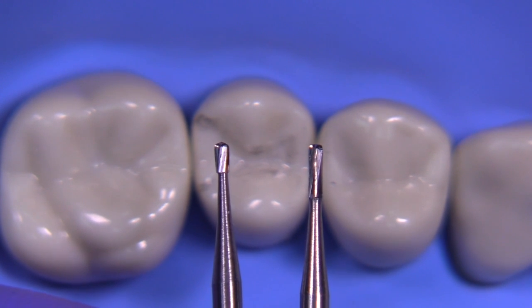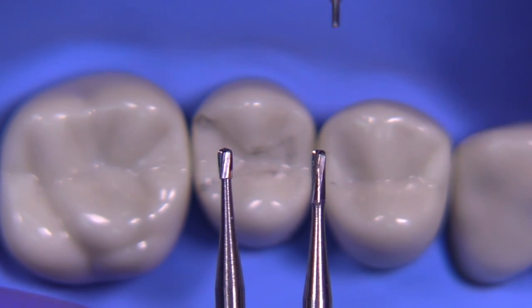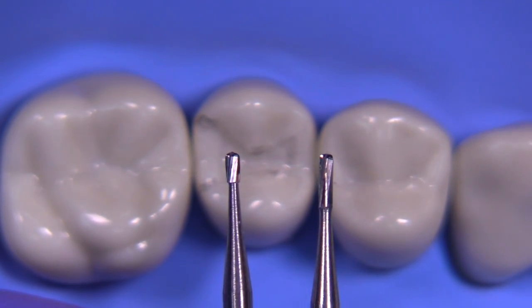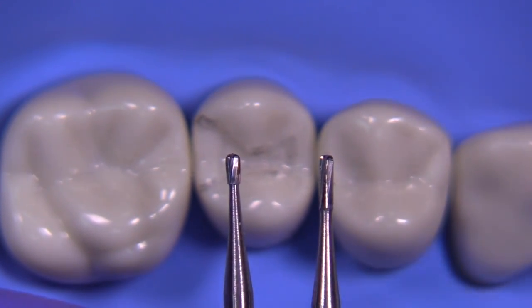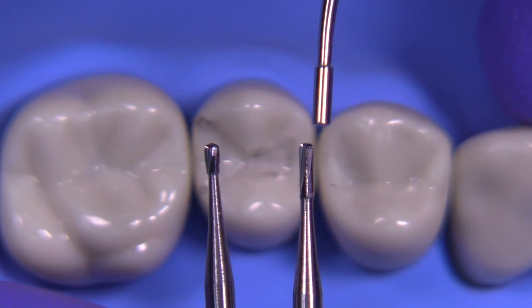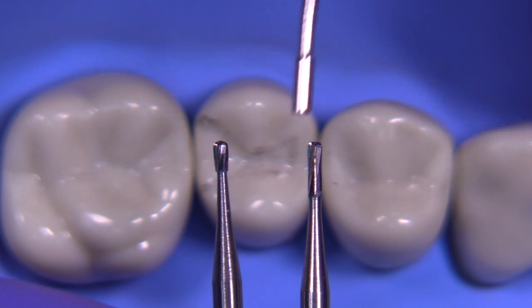We're going to use the 330 and the 245 burrs. Notice that the 330 burr is pear-shaped, as is the 245. The 330 burr is a little longer than the RGS1 — it's 1.6 millimeters in length versus the RGS1 which is 1.5. The 245 is 3 millimeters in length as you can see here by the RGS3, and it's less than one millimeter in diameter — actually 0.8 millimeters at its widest area.